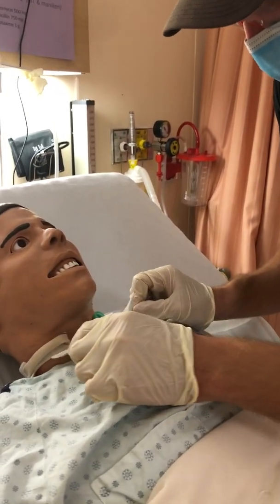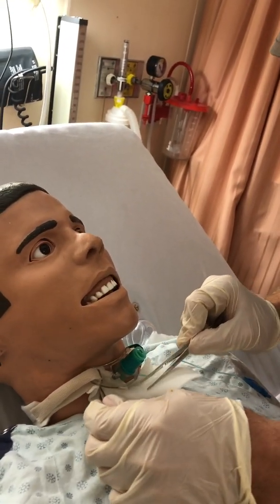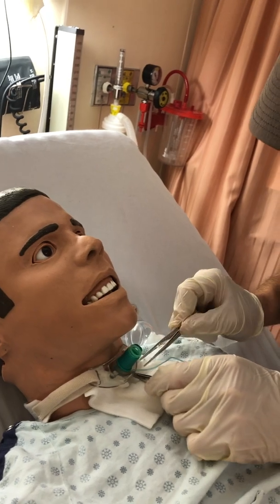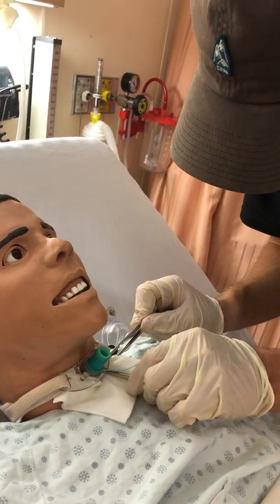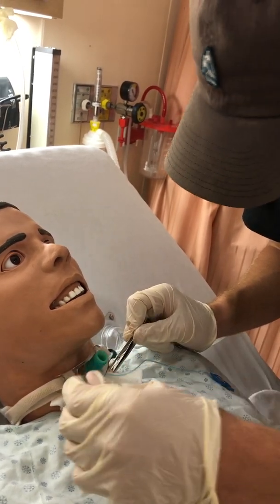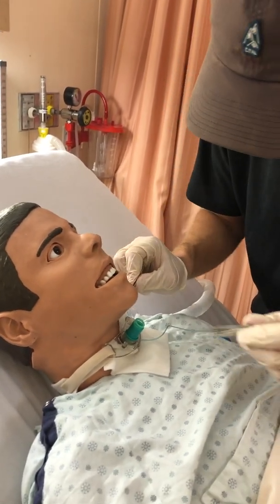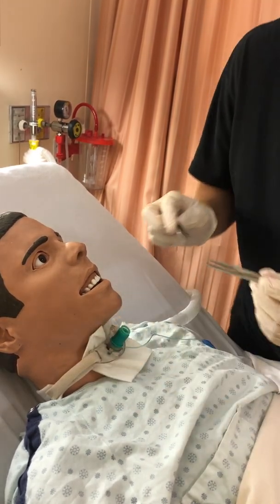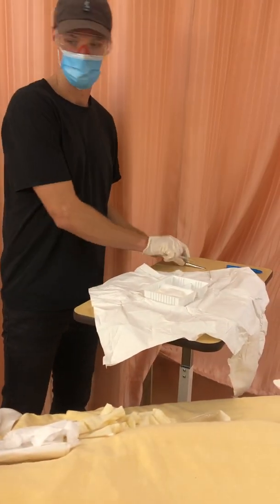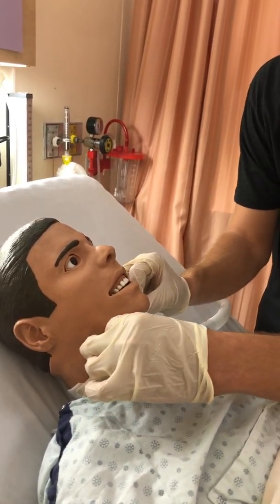So now what I will do is I will take off the old gloves, do hand hygiene, and grab the. This needs a lot more practice. So by just my knowledge, I know that the size 7 inner cannula is in place. Pull this through. I know that I need a suction catheter. These aren't sterile anymore, then I can pull these through. So that's good, it's on.